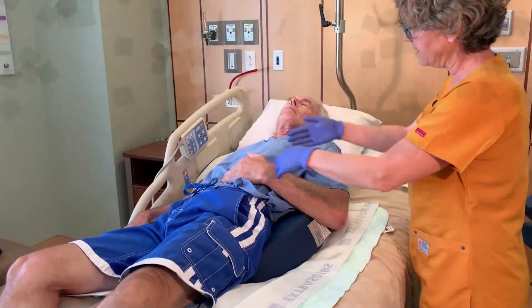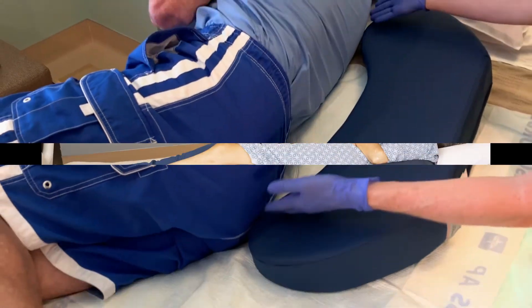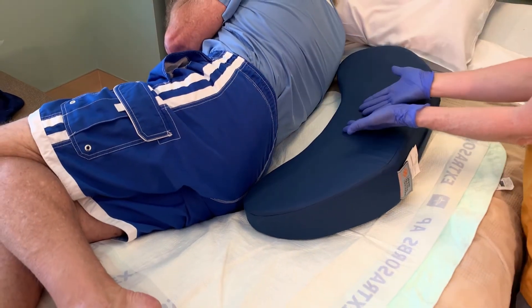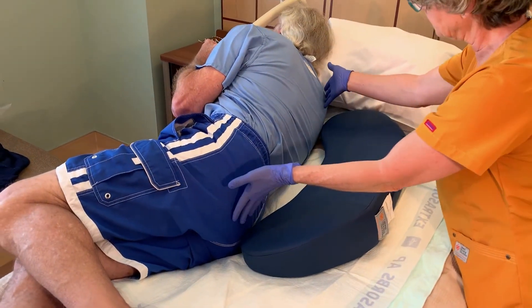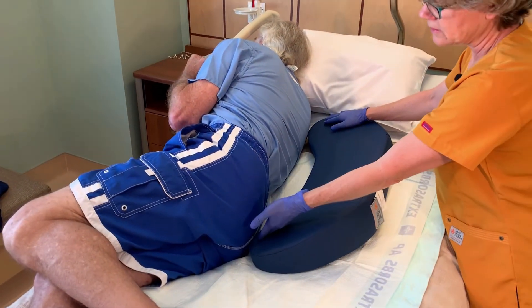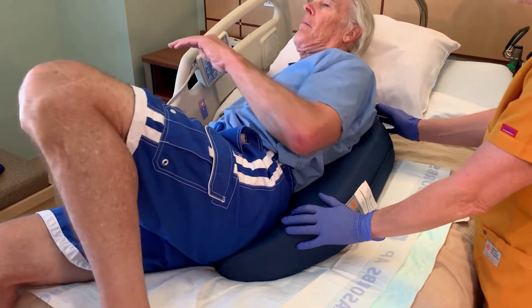What this means is their body has to be supported with musculoskeletal alignment — that means no twisting, no bending too far or straightening out too far. Also, the cushion has to support the body as fully and evenly as possible so that blood flow has the best chance of circulating to the wounded areas.